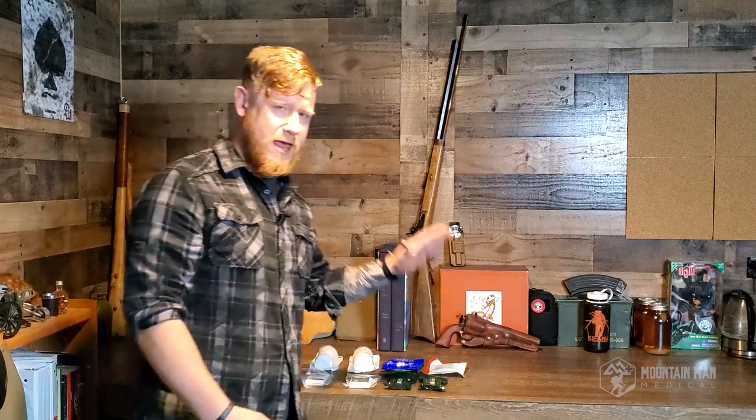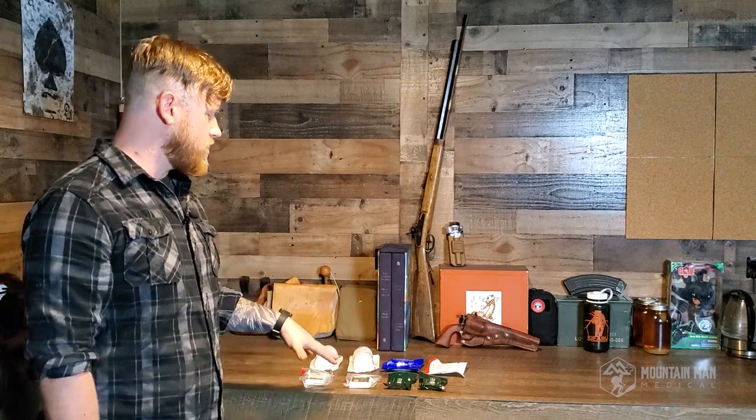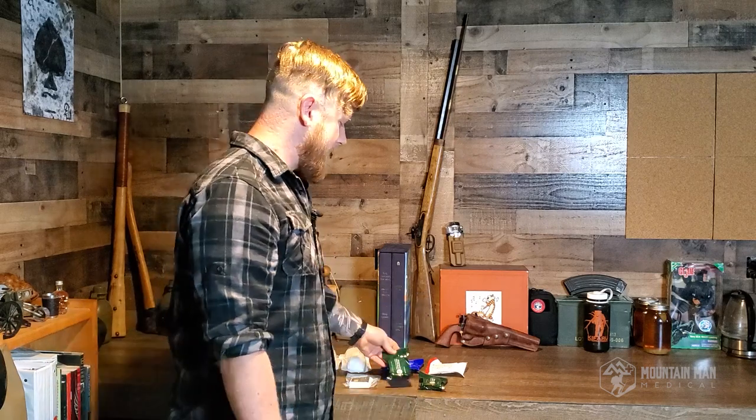Behind me, I've got a big array of the different types of gauzes that we carry at mountainmanmedical.com. We have a bunch of different types here. Some of it is big and bulky and others is nice and small and compact. We like to have small and compact because we don't want to be carrying a bunch of stuff and we don't want these huge medical bags, so we want to keep everything nice and tight and small.